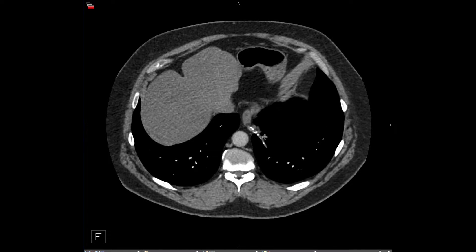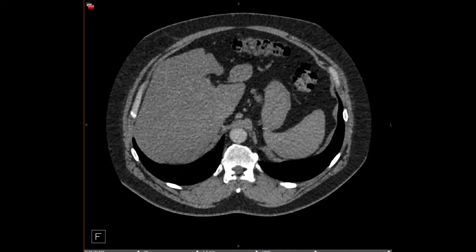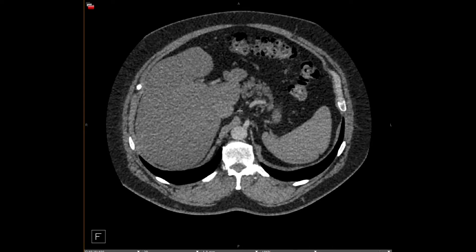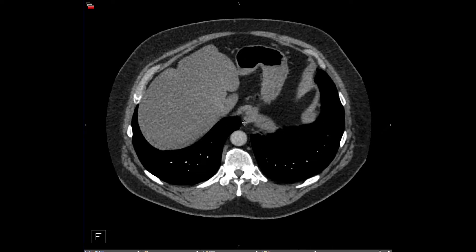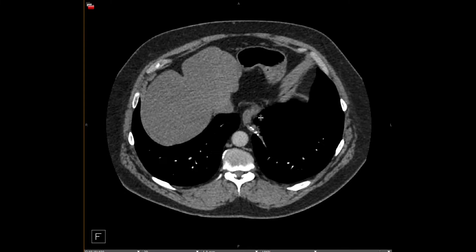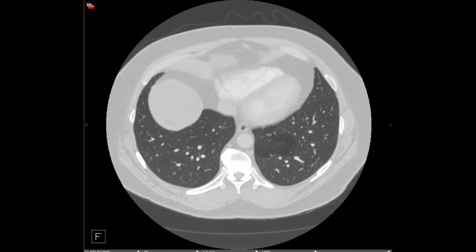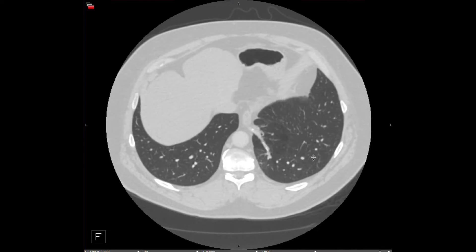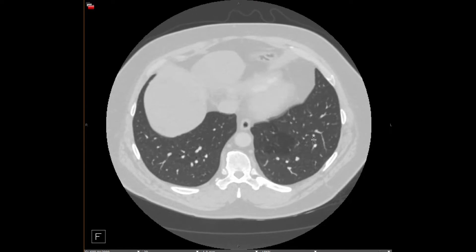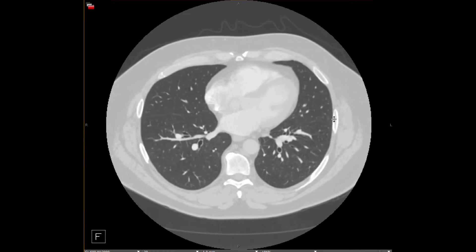In another example, there is atherosclerosis of the feeding artery, which is an abdominal feeder. You can see it arises from the celiac axis and then comes through the hiatus and feeds into this lesion in the left lower lobe. This is an overlap case with bronchial atresia — you can see a central mucus-impacted bronchus and air trapping in this lesion.